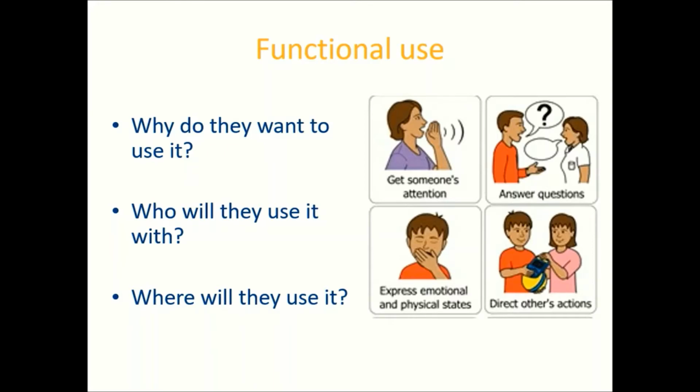And think about all the different communication functions. Does this person want to tell jokes? Do they want to be able to ask questions? Do they want to do a presentation? What are their goals? And lastly, where will they use it?